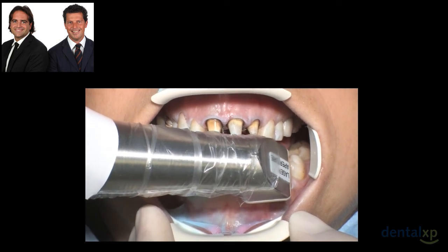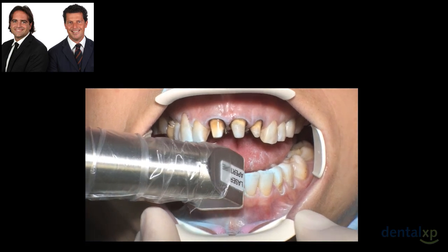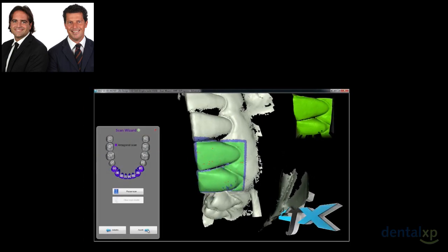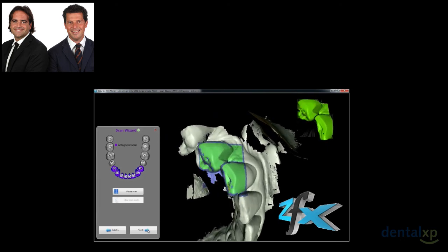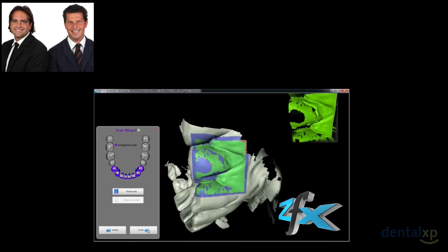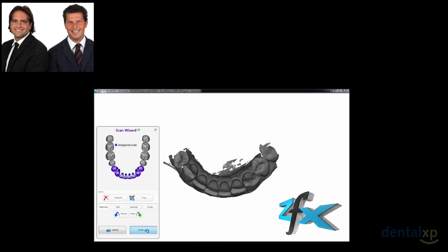So you can see again, this is the ortho retractor that we are using, and the assistant is helping us with his left hand. As you can see, the movements again are very slow, and you can see again all the colors that I was talking to you about before. The green area on the top right is telling you that you are doing good, so the photo shoots are overlapping correctly. You can cut the unuseful data and you can post-process immediately.